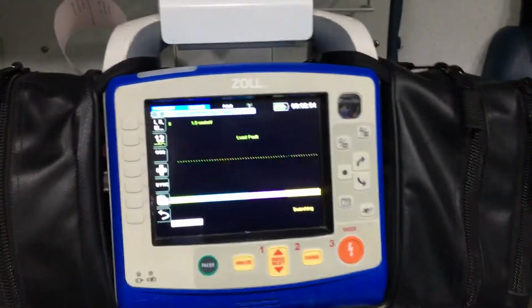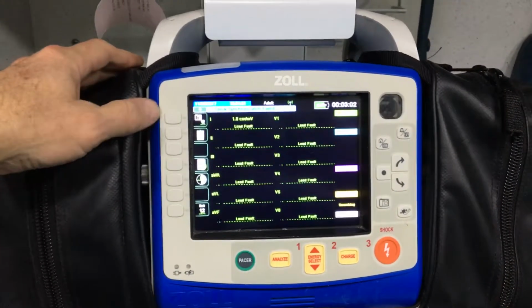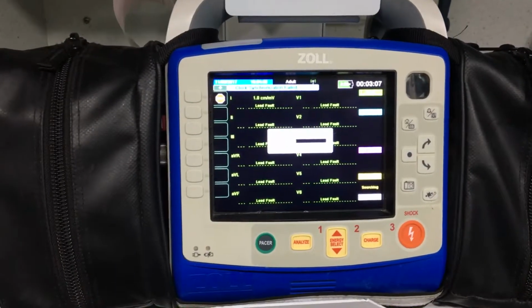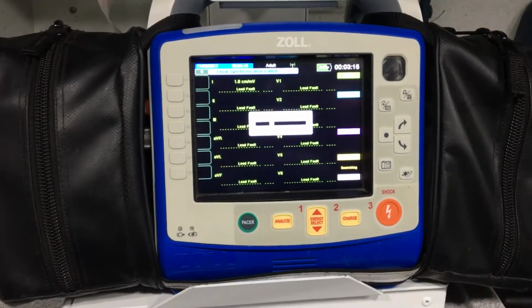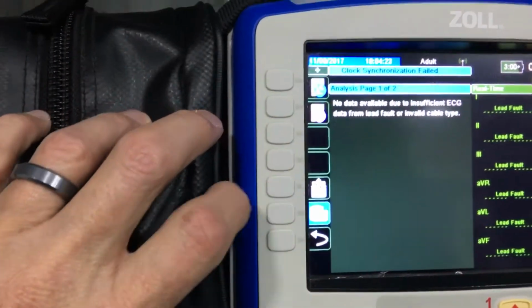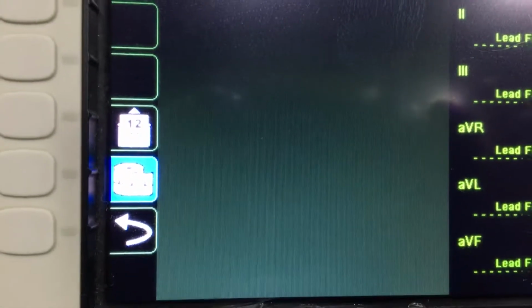It's also supposed to go to a couple different emails within the hospital. We're still testing that, but the other does work. So we do a 12 lead. Alright, so you give it a minute, but that envelope pops up, and I don't know if you can see it in here. It's got a number 12 for 12 lead.